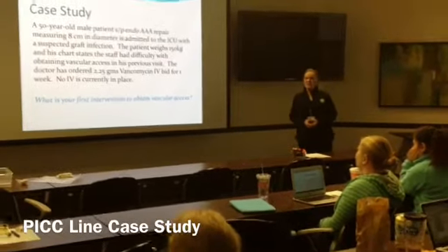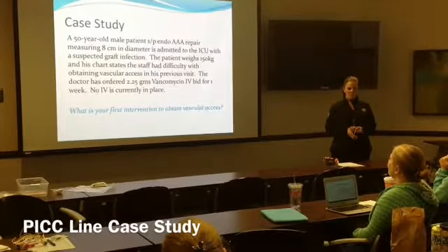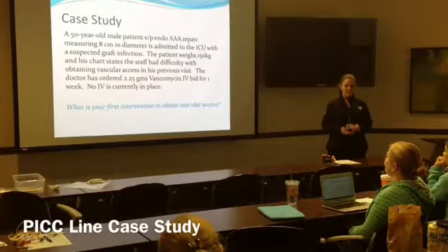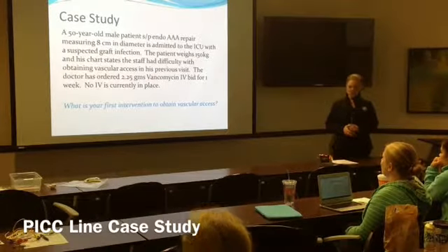So now we're going to do a case study. We have a 50-year-old male patient, status post endo AAA repair, measuring 8 centimeters in diameter. He's admitted to the ICU with a suspected graft infection.